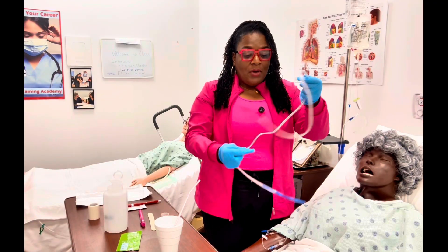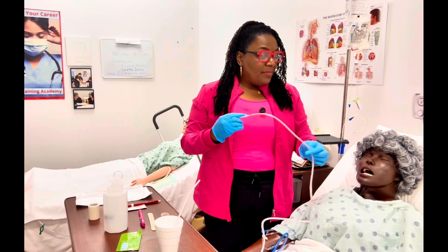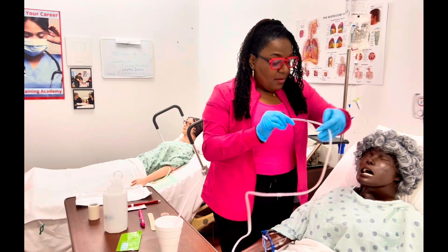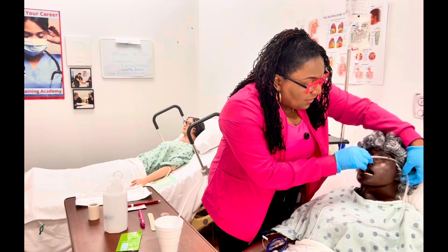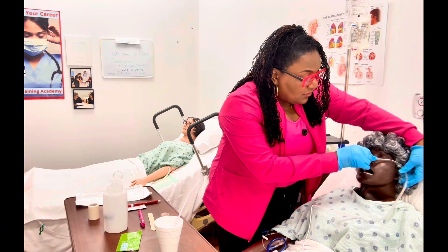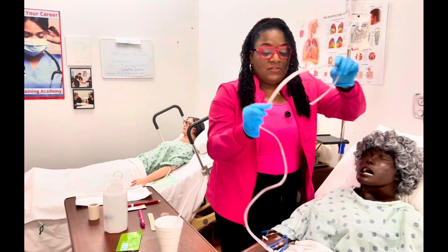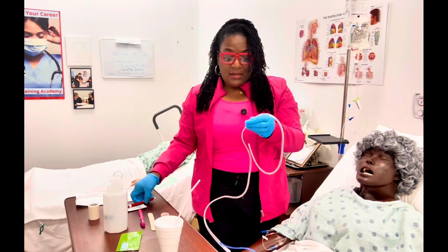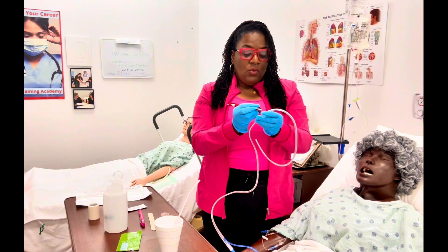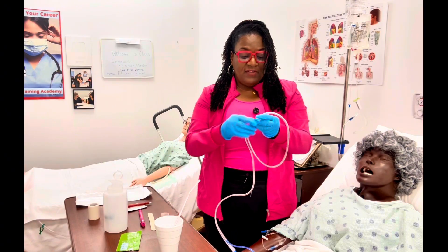Now that I've done my preliminary check, let's start measuring. I have my Salem sump — also known as my nasal gastric tube. I'm going to measure on the opposite side so you can see it better. The measurement is from the tip of the nose to the ear, then down to the xiphoid process — nose to ear to xiphoid process. We'll mark it, or put a piece of tape there, so we know how far to advance it.